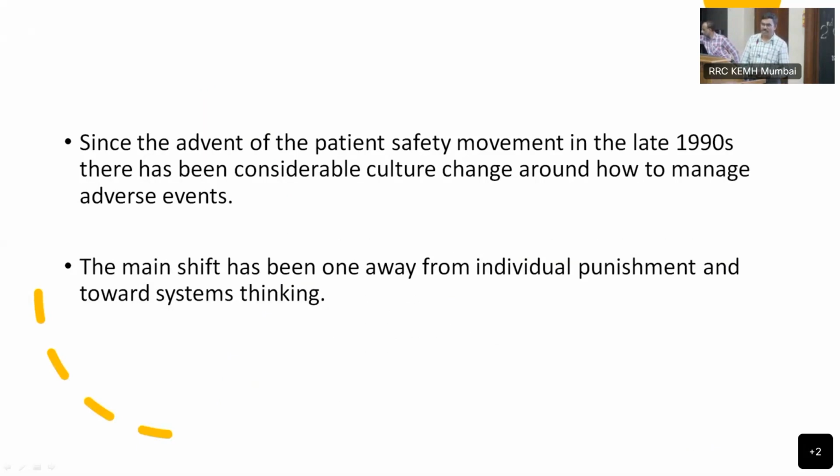It's unfortunate, right? Yesterday, one incident happened in my lab. We do so many double marker tests and prenatal screening on the machine. One of my technicians, day before yesterday, was doing pregnancy-associated plasma protein. He had loaded one plate. Every plate has a set of calibrators in open holes, and the rest, 80 or 82, were the samples. What he did was put one reagent in inadequately. What happened? The complete batch failed, the complete plate failed.